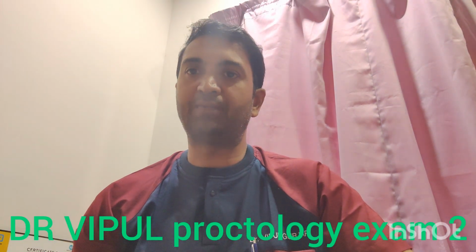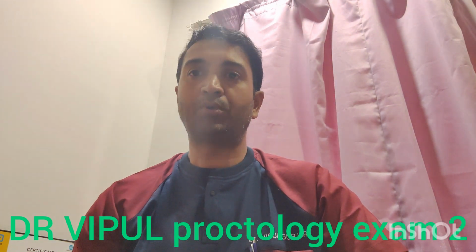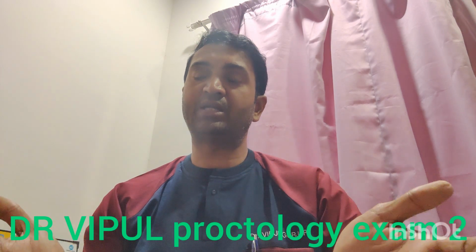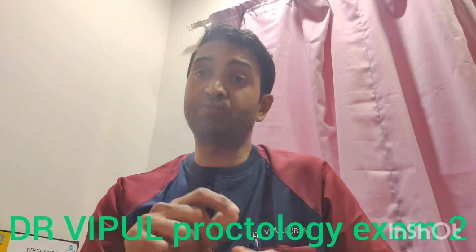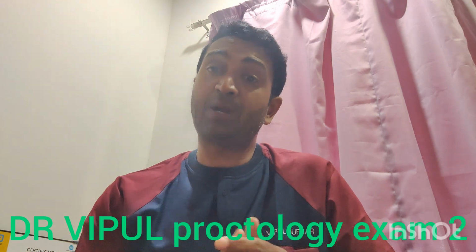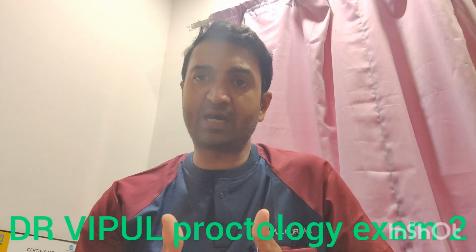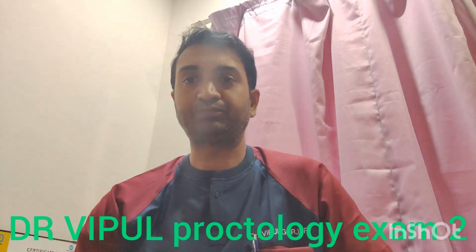Now to the proctoscopy examination. For this proctoscopy examination in adults you should take a larger diameter proctoscope and a smooth surface proctoscope. Many times we use proctoscopes from different companies, and they remain in a single tray. That's why the obturator, male and female obturator, will not fit, and if you insert this proctoscope, the patient will have bleeding and trauma. So ideally, you keep proctoscopes of a larger diameter, as well as from one company, so it will not mismatch.